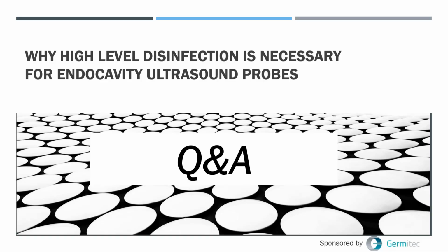Disinfection then is a chemical or another means, in this case, we've talked about UVC light irradiation, for actually killing microbes. So that's the difference between cleaning and disinfection. They're synergistic and additive. They should always be used together to achieve the maximum removal of microbes in order to protect your patients.